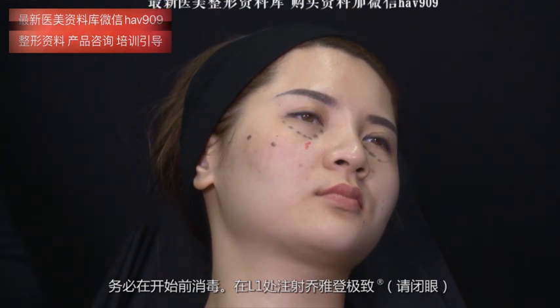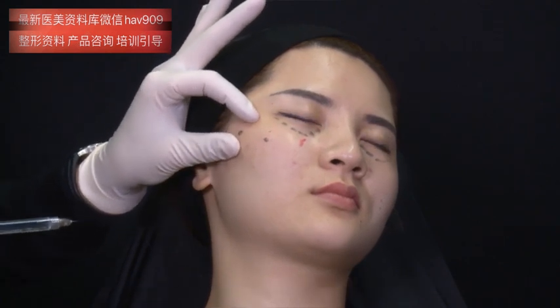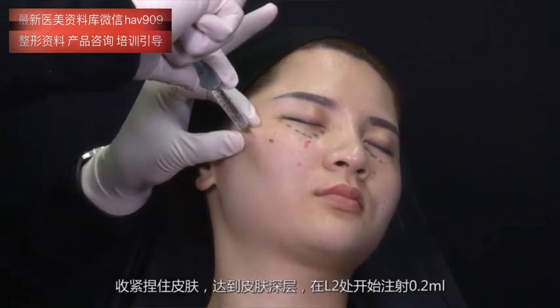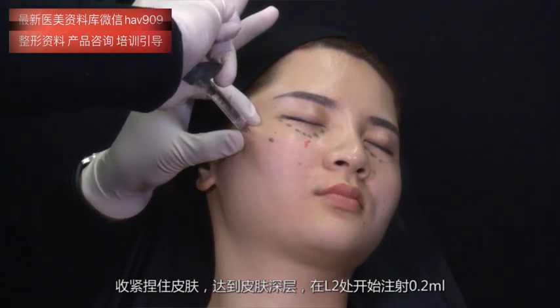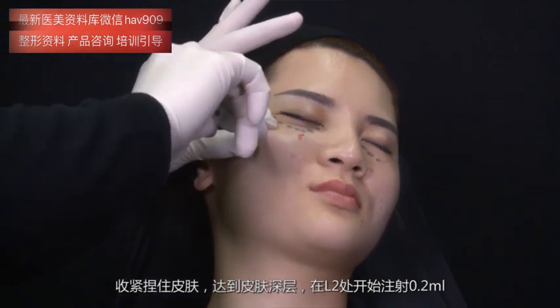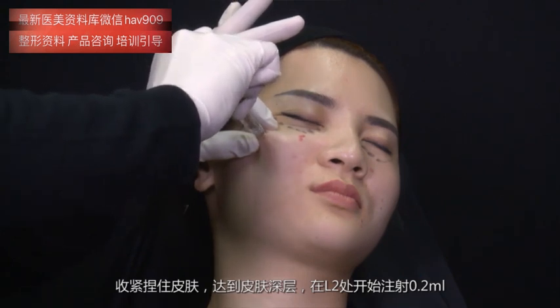For L1, we have to use Juvederm, close your eyes, Ultra Plus. Retract, pinch, and touch the deep plane. I'm now injecting 0.2 and 0.2 in L2.